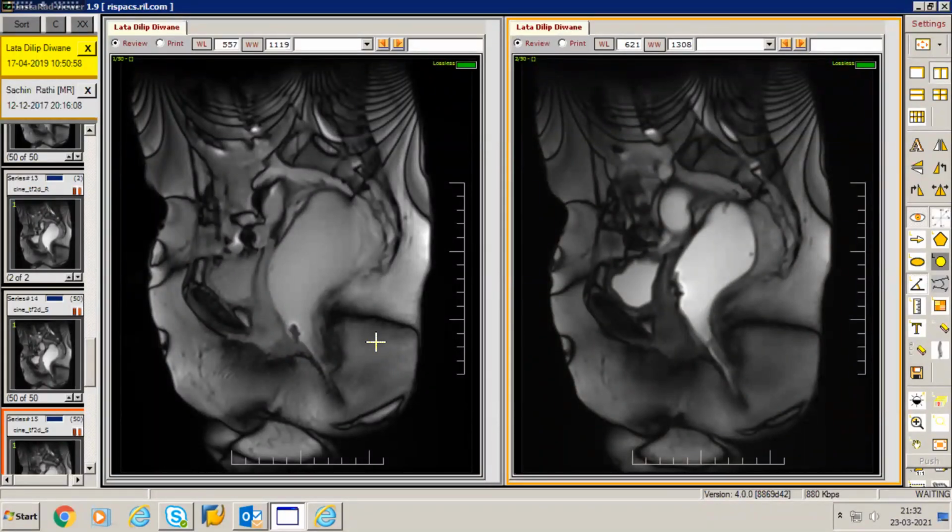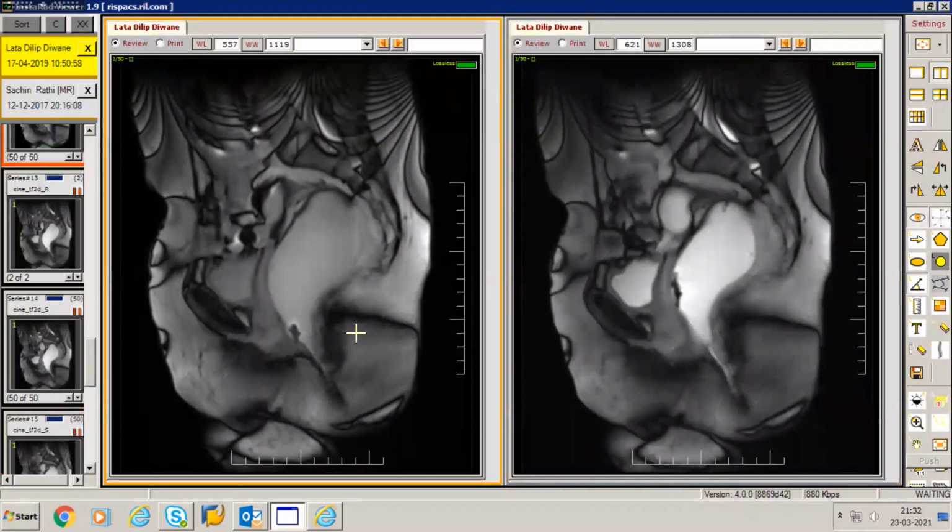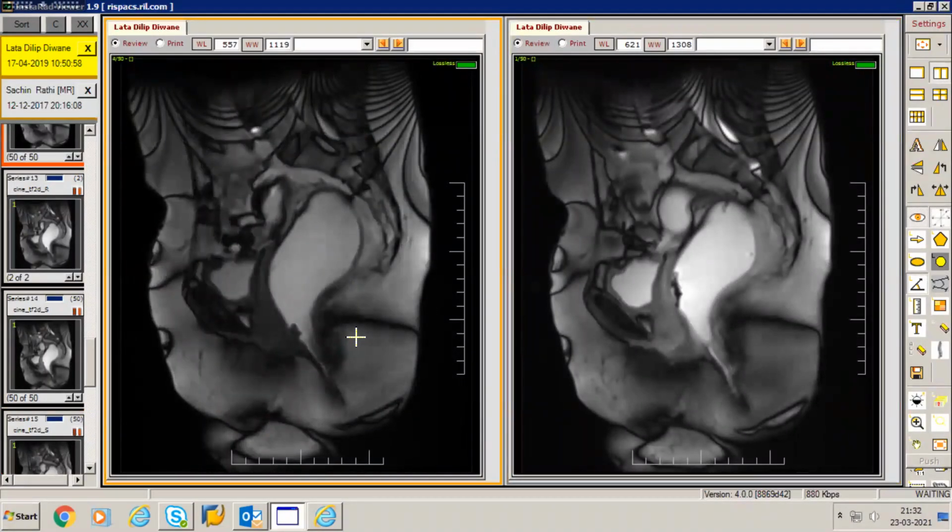Okay, so again, as we are seeing, this is a sagittal T2 weighted image which you are seeing over here. And this is the patient when he's at rest. So you're not giving the patient any kind of commands. You basically have instilled the rectal jelly into the patient and ask him to just lie down on the machine and perform the scan when it happens.